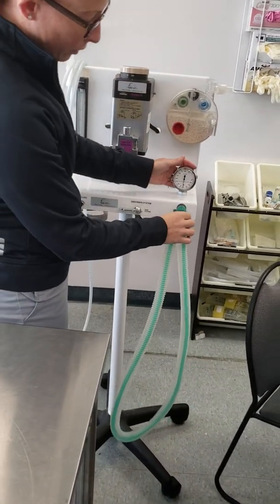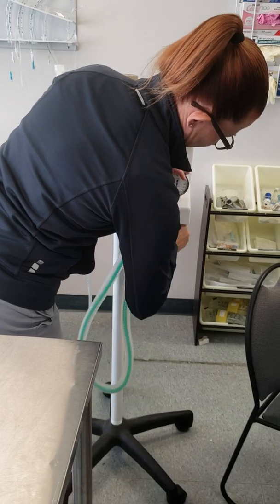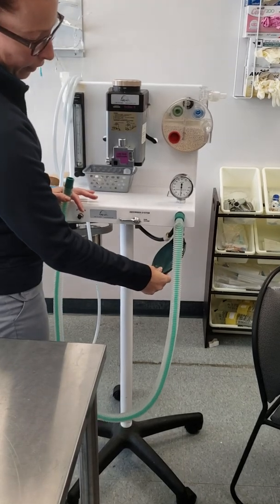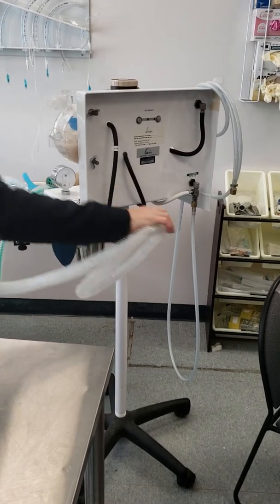That's always closest to the pressure manometer here. So it comes out there, and my bag is underneath that. Okay, these things are always really close to each other. From here, the patient breathes out. It goes either into the bag or out the scavenge, and my scavenge hookup is here.